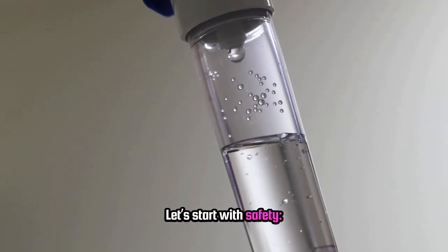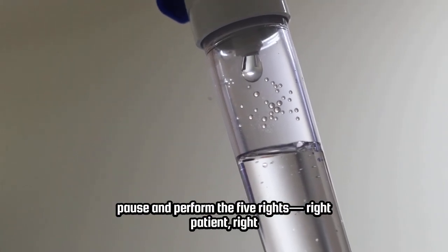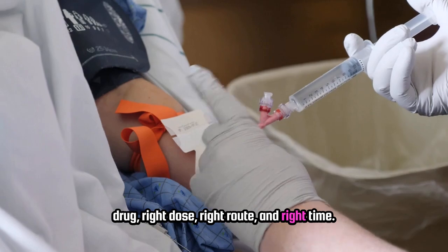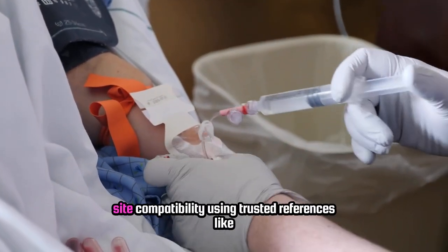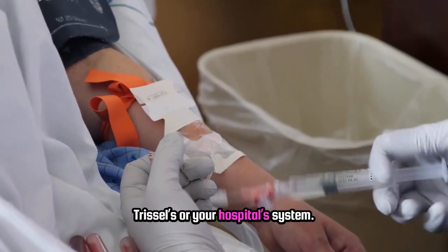Let's start with safety. Pause and perform the five rights: right patient, right drug, right dose, right route, and right time. Check for allergies and confirm Y-site compatibility using trusted references like TRISSEL'S or your hospital's system.